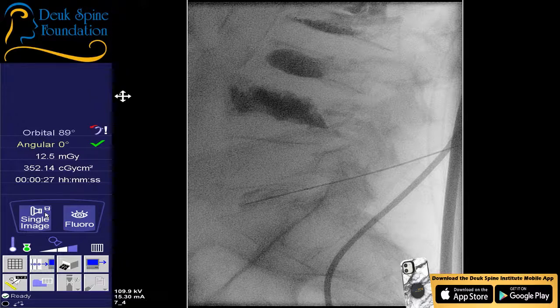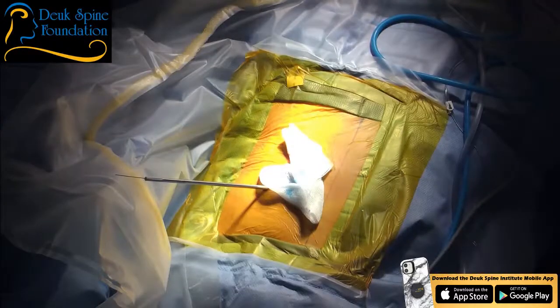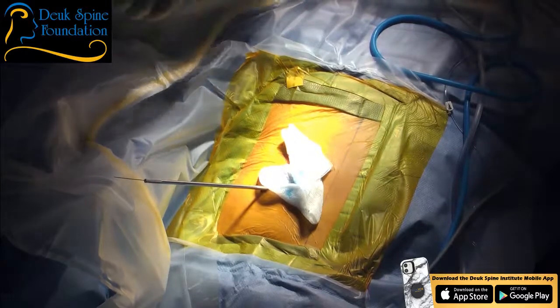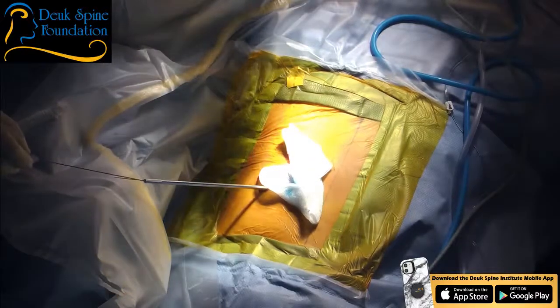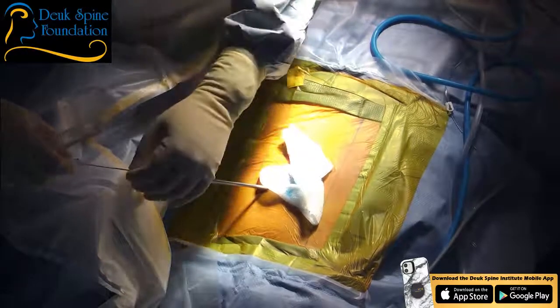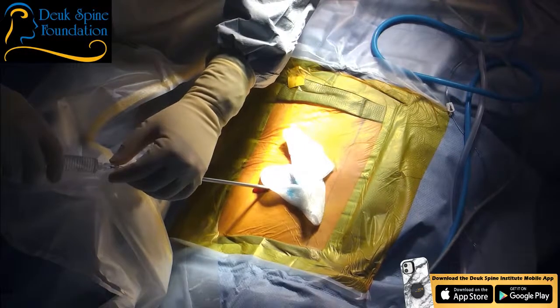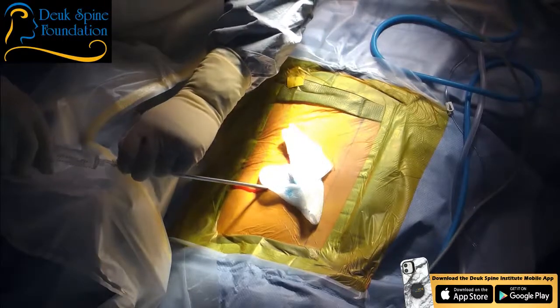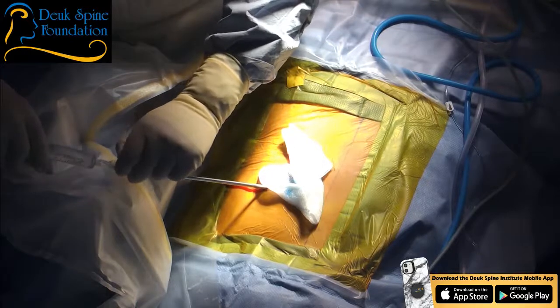So it's a 7mm incision. Now, this is going to be the more stimulating part. So what I'd like to do is, and do we have a needle? A what? I think, what about the 22? Oh wait, no, the 18's okay. I'm going to numb things up a little bit as I go in. It's a little different than we normally do, but should be fine.